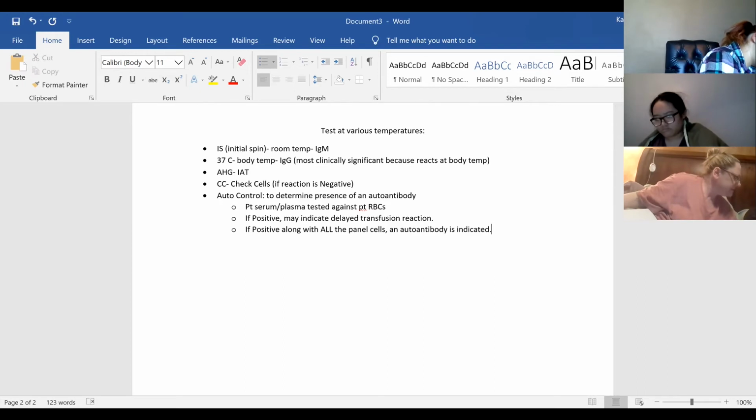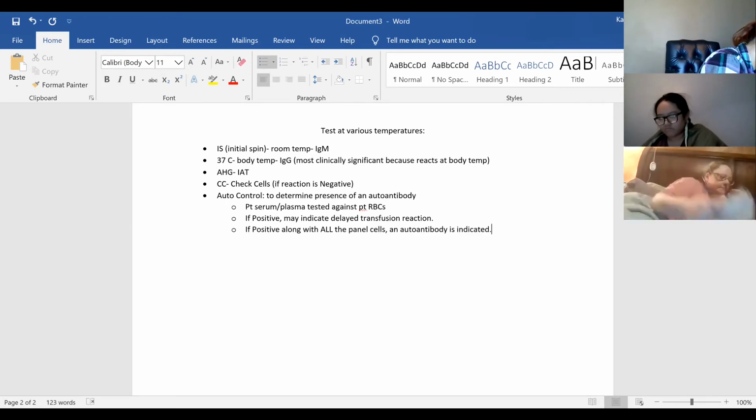We do the sensitized cells and the potentiators and the bovine serum. One more time. The IgG sensitized cells, the polyspecific AHG, and then the potentiators. Yeah. And the bovine serum albumin. Okay. And then it goes into lectin. Yeah, and I've got those saved.